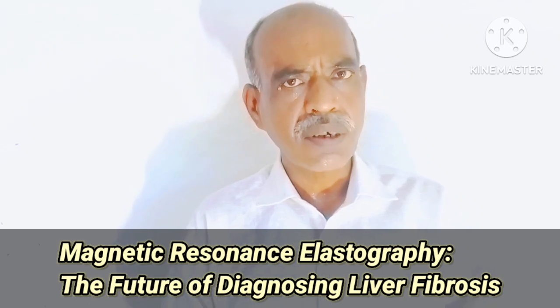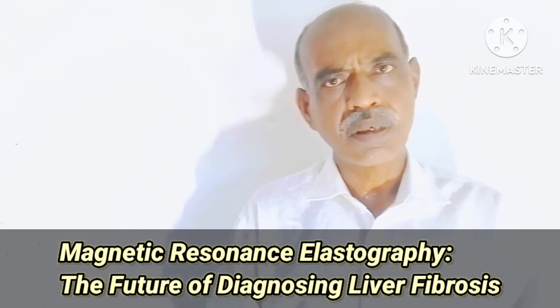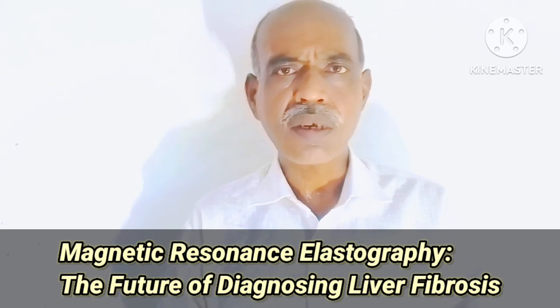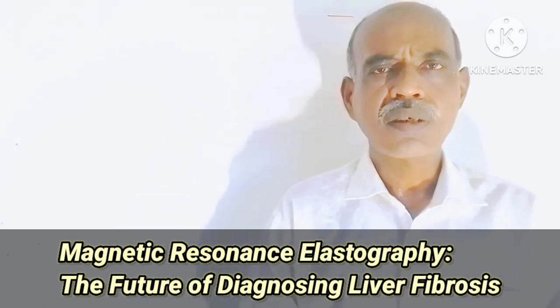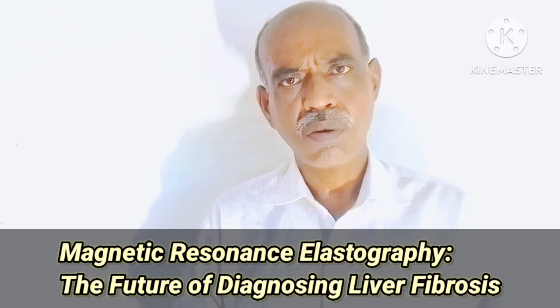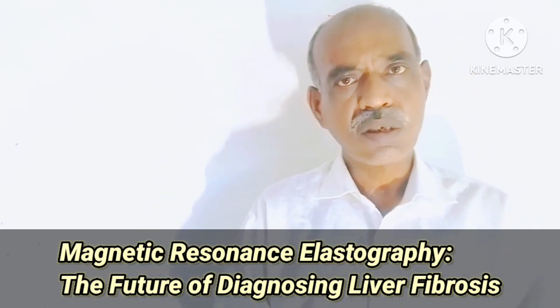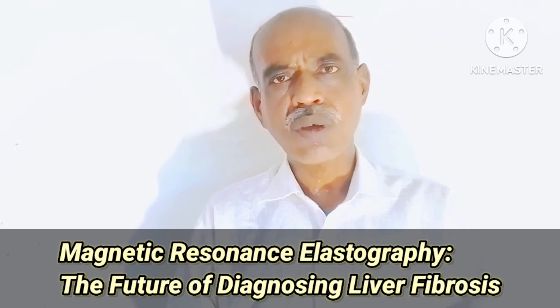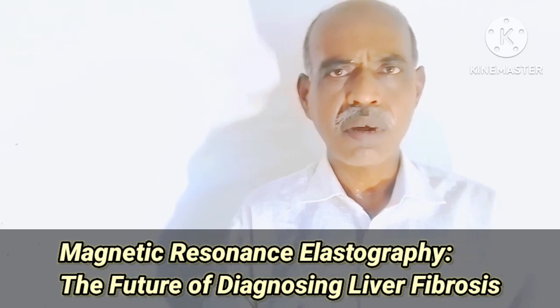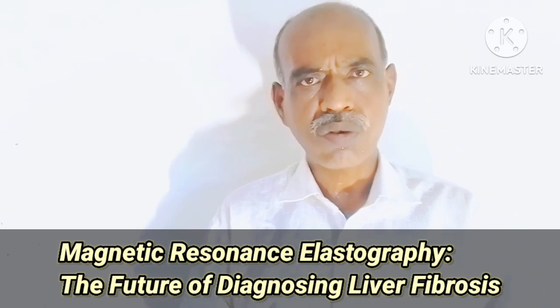Again, non-alcoholic liver diseases are there. So everything related to liver can be known accurately by using these techniques. And that's why this combination is required. Both are used simultaneously, and that's why a new name is given, MRE, because it produces the result known as elastogram.